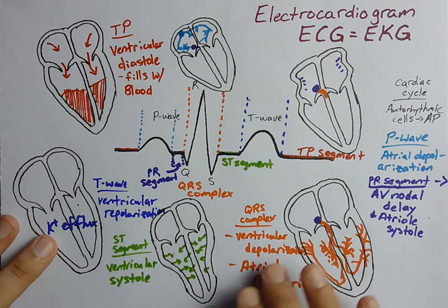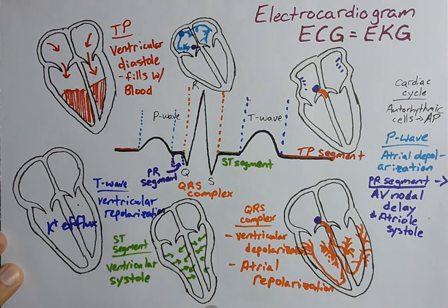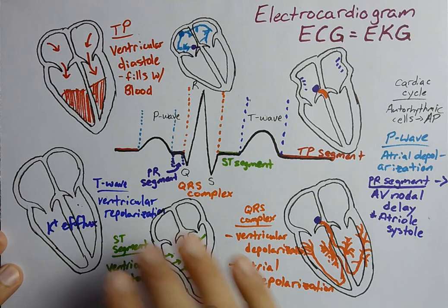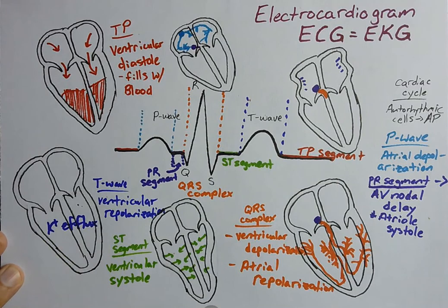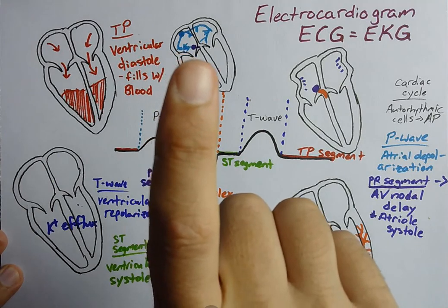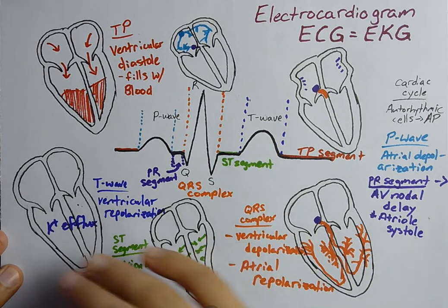After the ventricular depolarization, the ventricles get to contract. Ventricular systole occurs during the ST segment. Following contraction, they start to repolarize, and that repolarization is a massive flood of potassium rushing out of all those myocardial cells. So you actually see a very large wave of current. One side note that I didn't mention before is that potassium efflux is normally associated with repolarization, and when you draw an action potential, repolarization goes from a positive value towards resting membrane potential, which is a negative value.